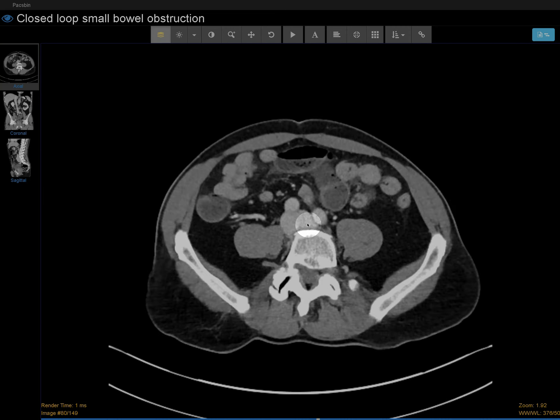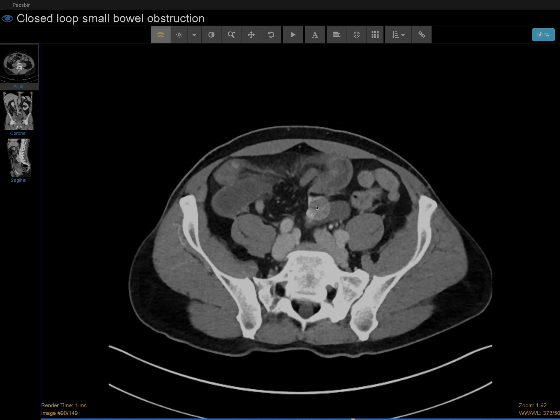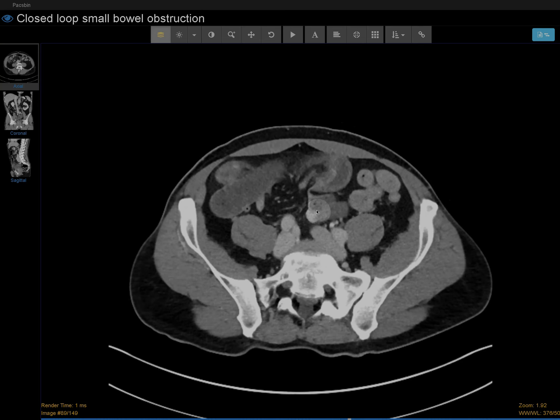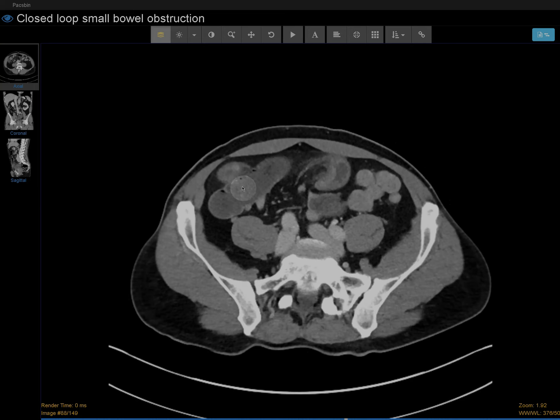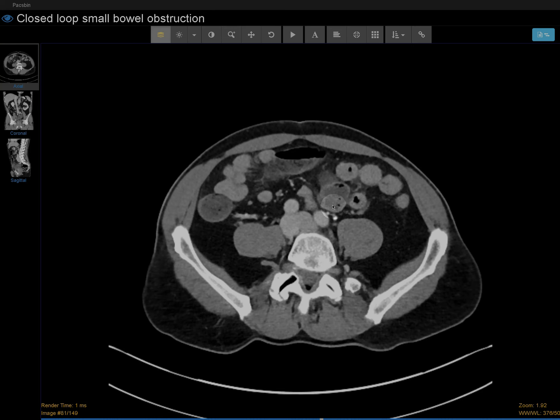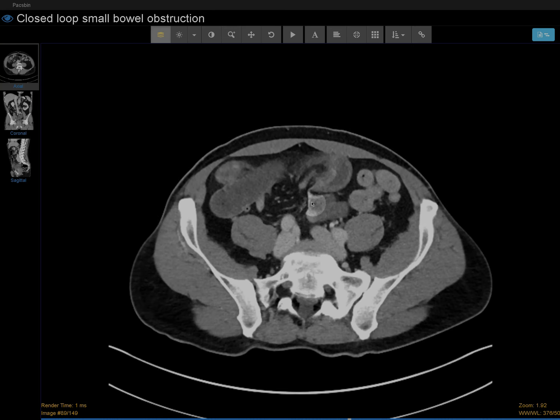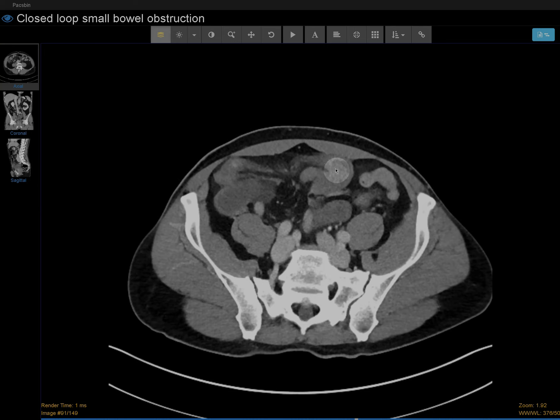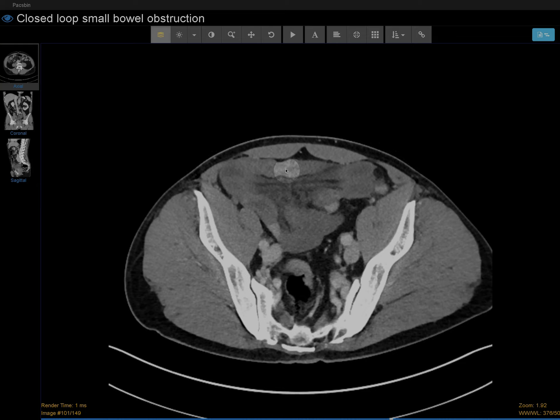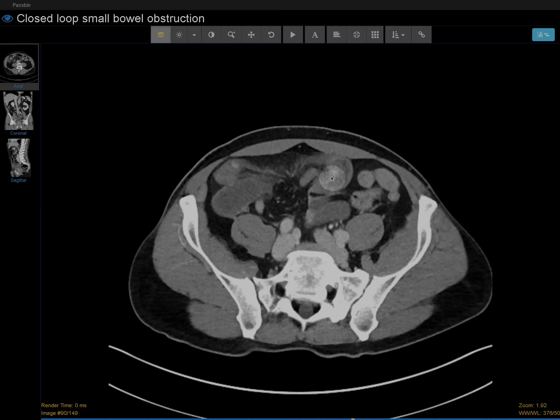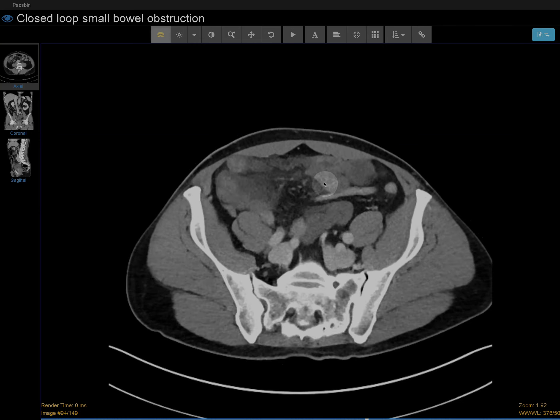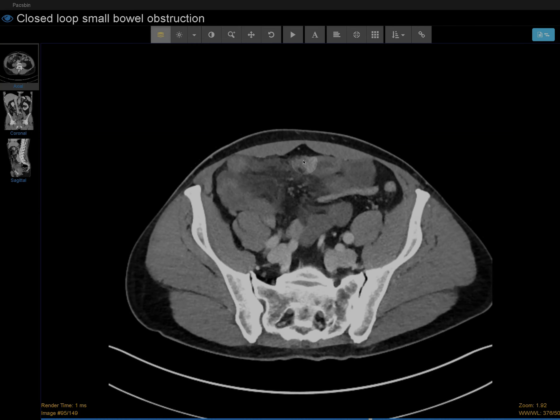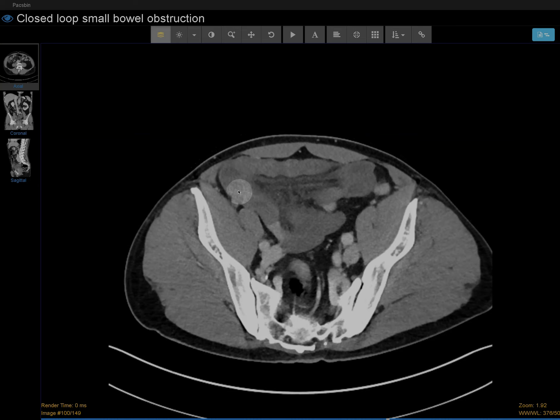Let me show it in a different plane. That's one birdbeaking — this is the proximal-most bowel. Up here there's stasis and fecalization of the interior content. Down here is where the obstruction starts. The bowel loop here is not as abnormal as further down, but we start to see the gradual loss of enhancement.